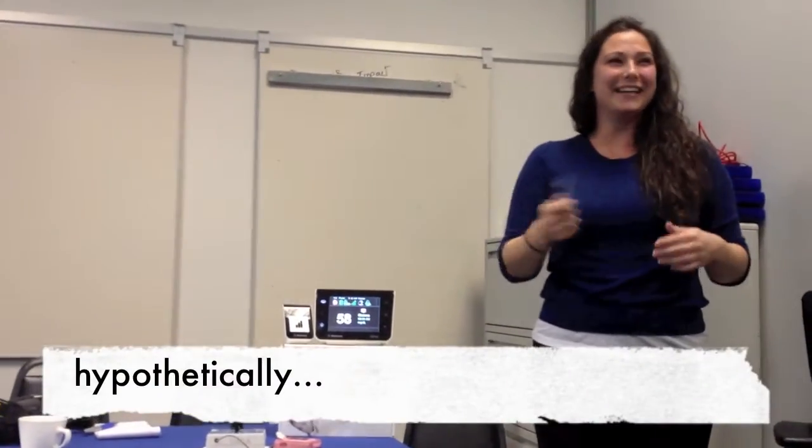What if you don't change your sensor? Because I know that hypothetically. You want to stretch that sensor.